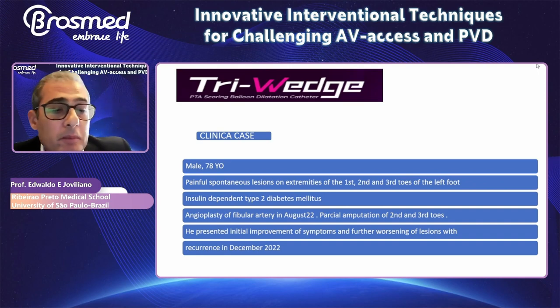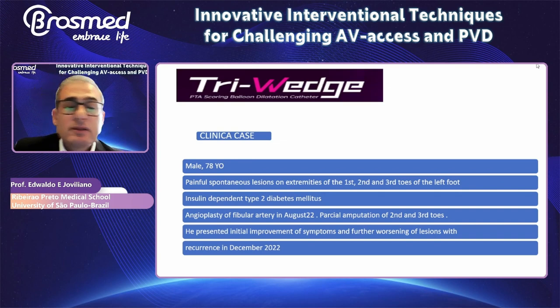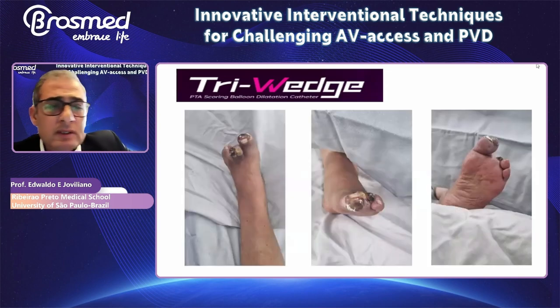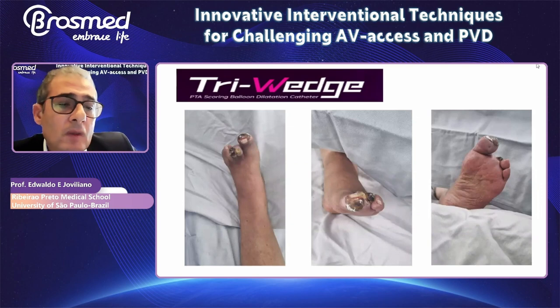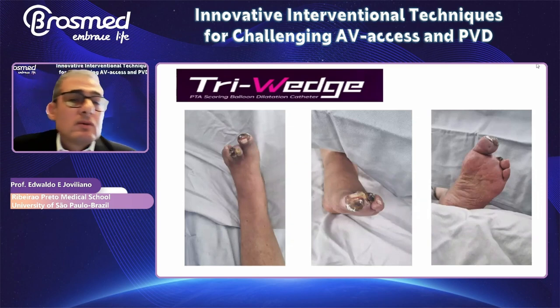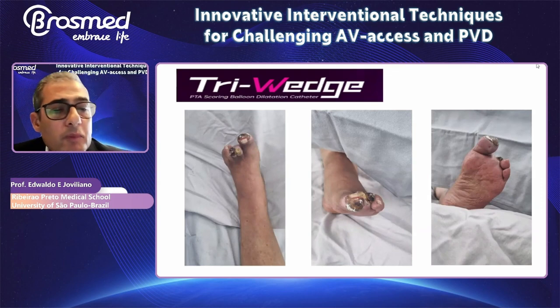He had been submitted to angioplasty of the fibular artery in August 2022, with partial amputation of the second and third toes. He presented initial improvement of symptoms, and then further worsening with lesion recurrence in December 2022. So this is the case that we have to manage. The patient had a really painful disease.